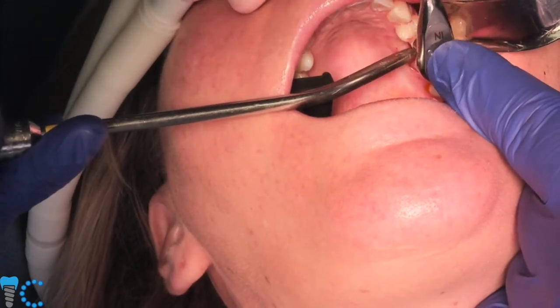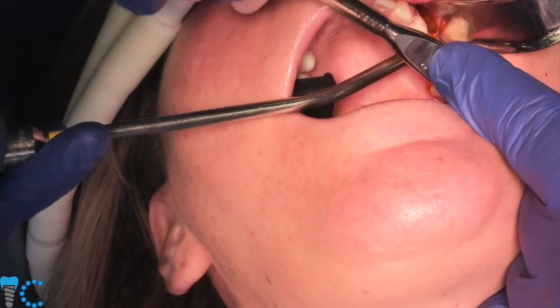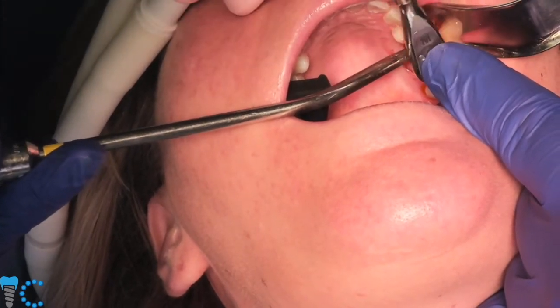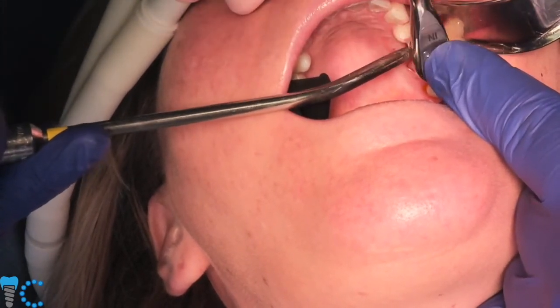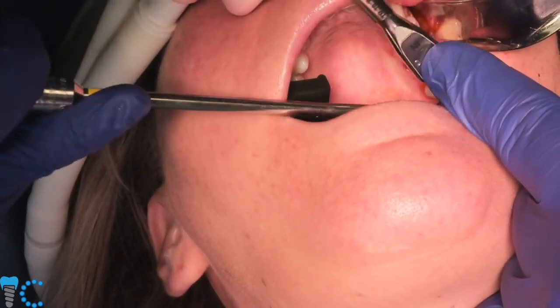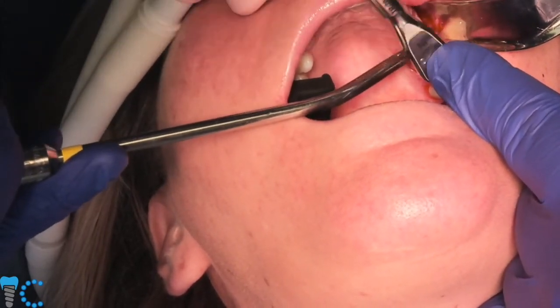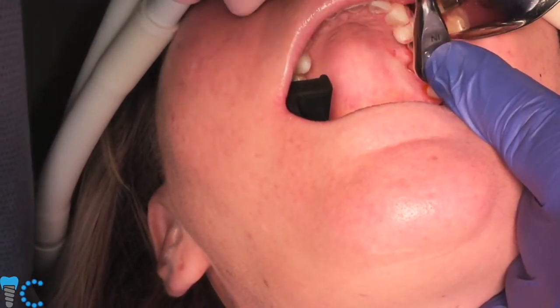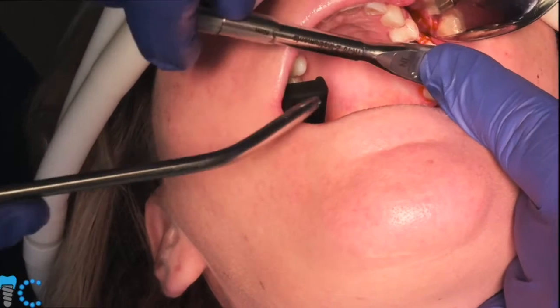Zirconia implants take a lot to manufacture. It's not like a titanium bar that's quickly milled and sterilized in order to have the processing that allows the structure to be as solid as it is. It's quite an endeavor. And then we also are the only company to plasma sterilize. So we have those benefits as well.